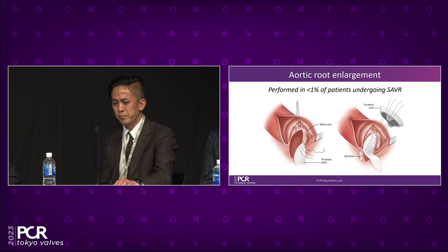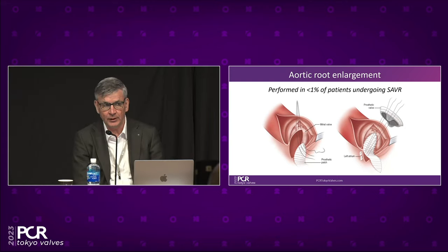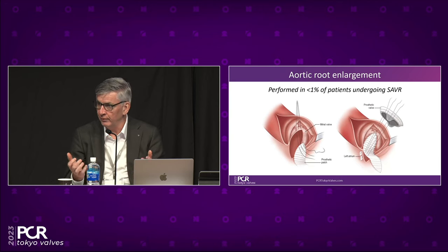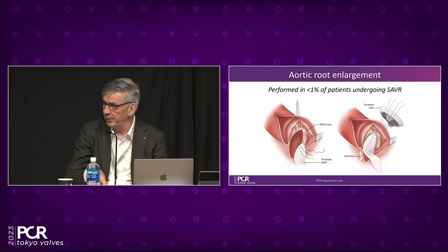Yeah, that's exactly as you said. This is one option if the patient is going for surgery: to ask the surgeons to do what we call root enlargement. They transect the aortic annulus and put a patch in, and thereby can get a bigger surgical valve prosthesis in and a lower risk of PPM. The problem is just that most surgical sites will not use it. And also, if you haven't recognized it up front, you don't know it's a small aortic annulus, and the surgeons may not be prepared for it.